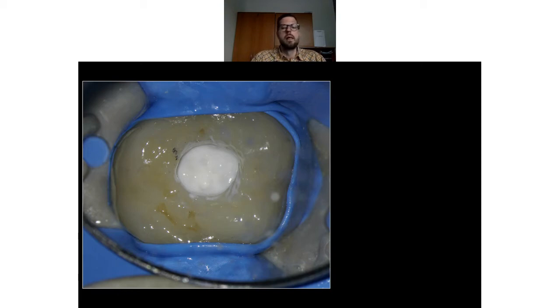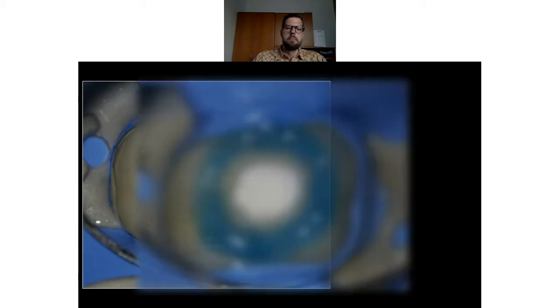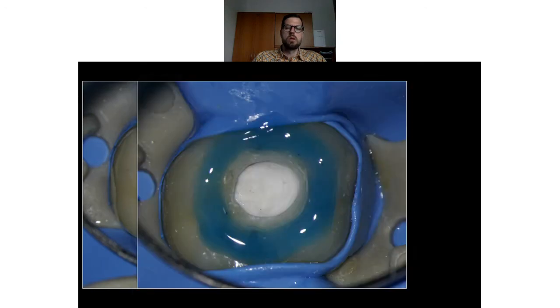So in the future, as maybe there is the chance that we must go inside the tooth, it's a little bit easier to get rid of this cement, because it is in a white color. Then we can protect the ceramics.